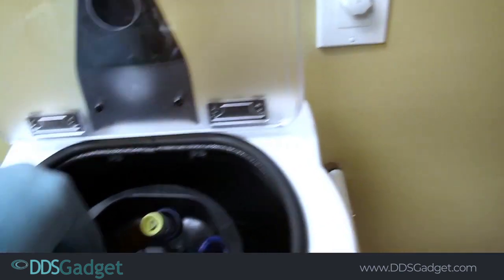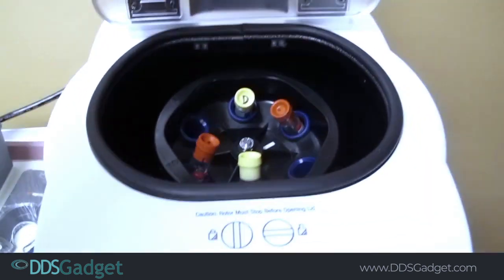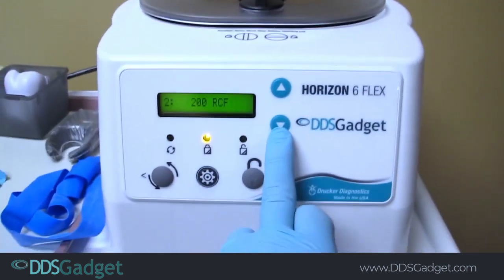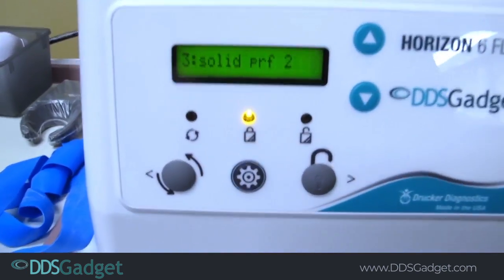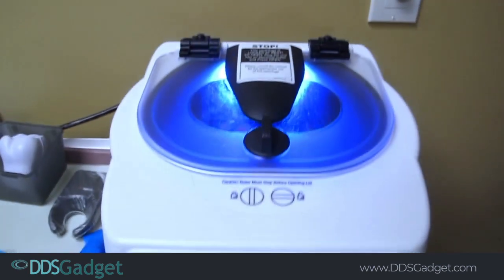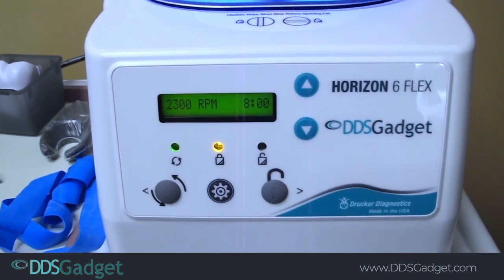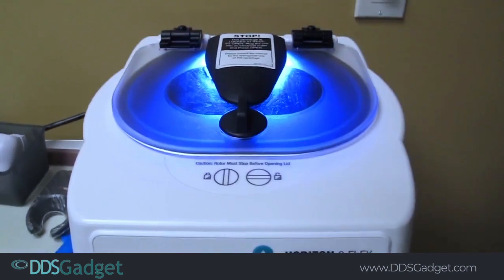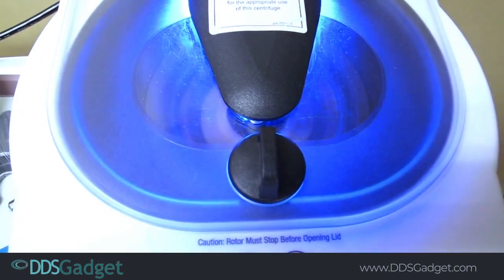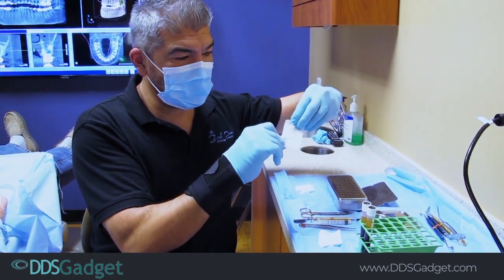We're going to move the tubes around to balance better, close the lid, and change it to setting three for liquid PRF. We're going to hit the start button and centrifuge these for eight minutes for PRF in the glass tubes.